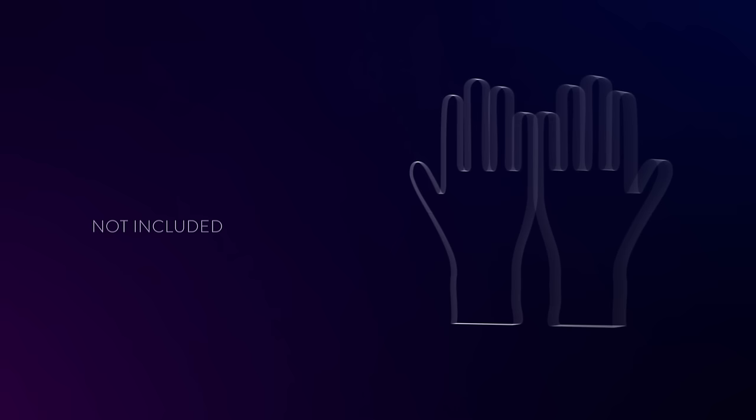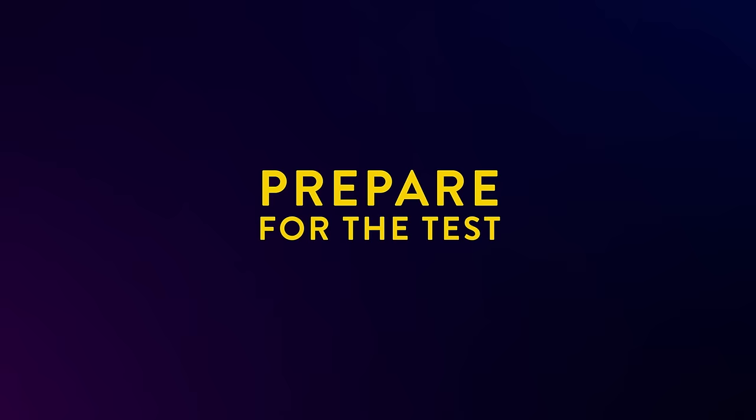First, prepare for the test. Wash or sanitize your hands. Make sure they are dry before starting.